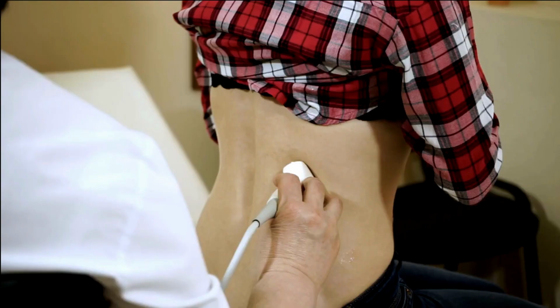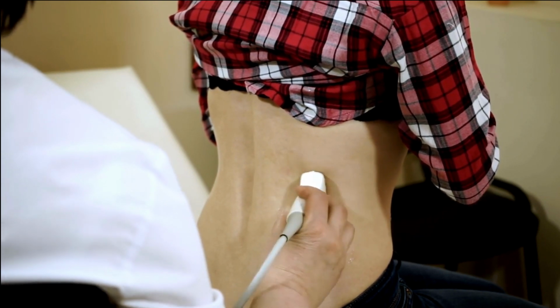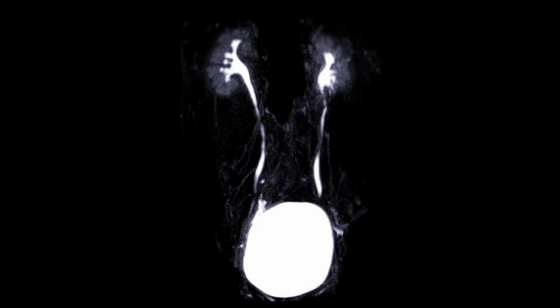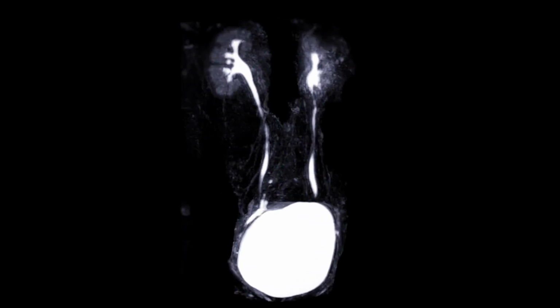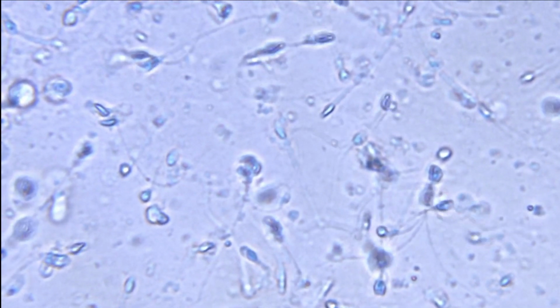In cases where renal proteinuria is typically seen, there has been some kidney damage or damage in the tubes leading into the kidneys or out of the kidneys. If post-renal proteinuria is seen, this may indicate that there is some damage in the bladder, in the ureters, the tubes going from the kidneys to the bladder, in the prostate in the male, or in the vagina in the female. The causes could be bacterial or fungal, or possibly from blood that is excreted during the menstrual cycle. Prostatic fluid and spermatozoa can also contribute to protein seen in the urine.